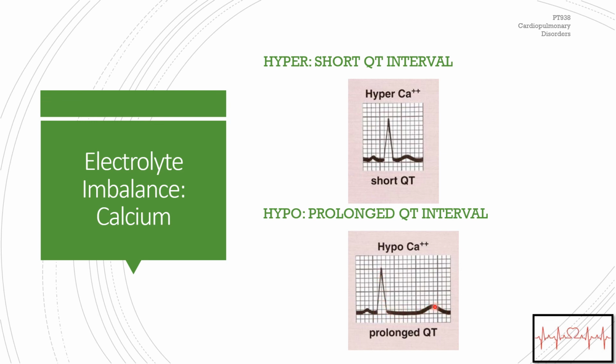So this prolonged QT, you should know, can precede torsades. And so we don't want these prolonged QTs because it can often lead, again, to some arrhythmias we surely don't want. All right, I know that was a lot. Come back with questions and we will review all of this together in class.